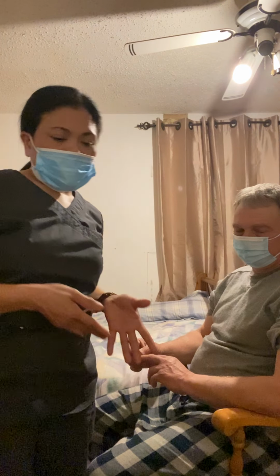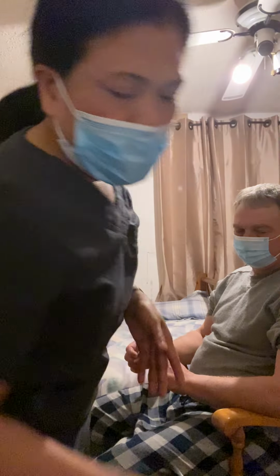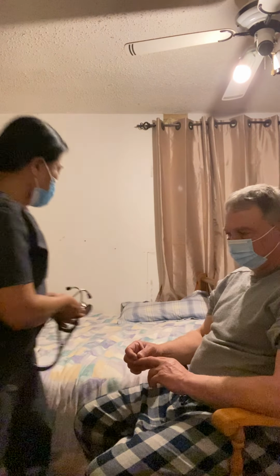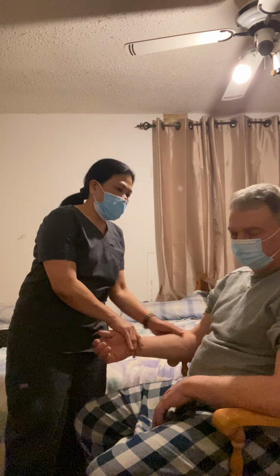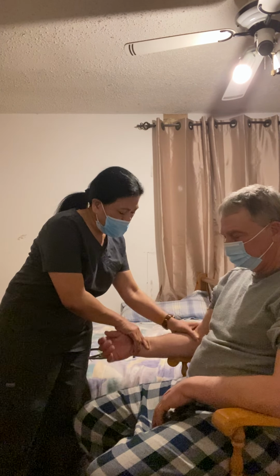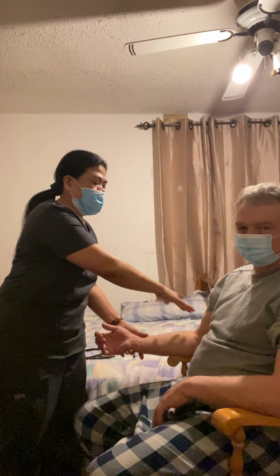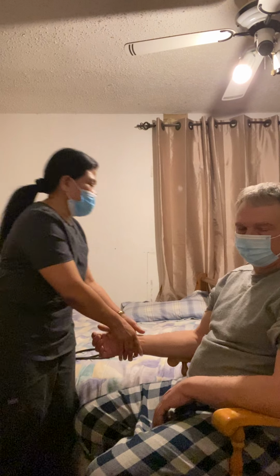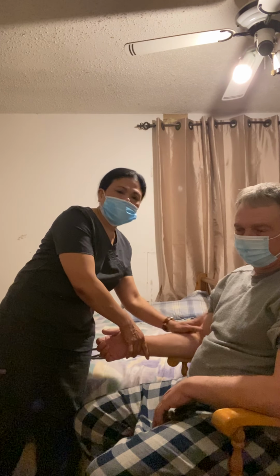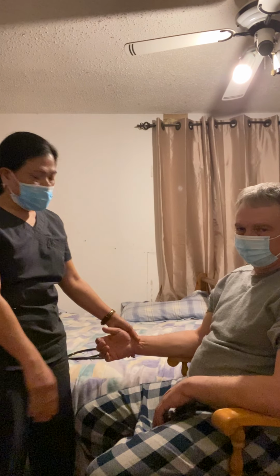So the next thing we're going to do is take the patient's blood pressure. To do that, we're going to find the brachial artery. We want to make sure that if the patient is sitting down, the arm is at heart level, the arm is supported, and the legs are uncrossed.